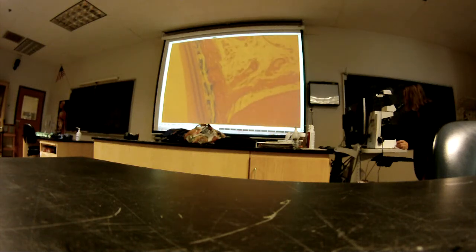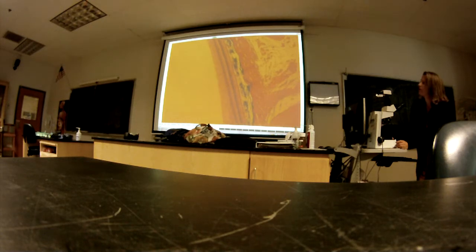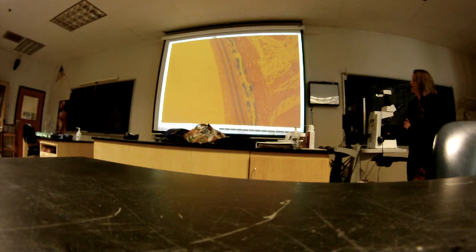Okay. So here you should be able to look up there and recognize that same organization of the wall of the eye, with the three main layers. Can you see it up there? Yeah? Okay, so that's what's sort of normal.